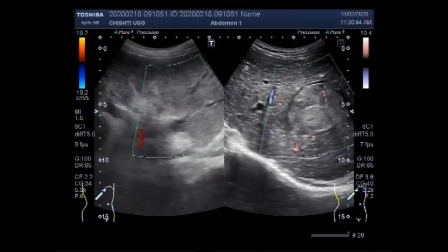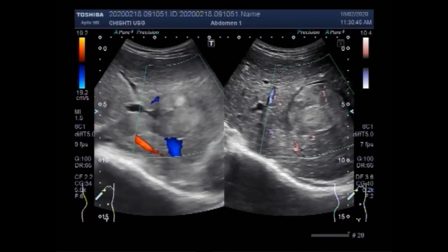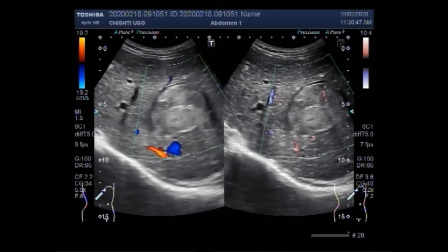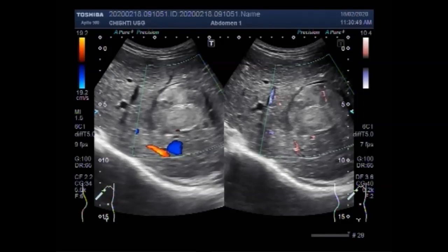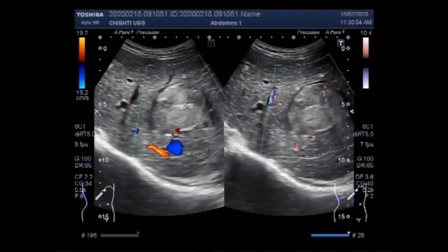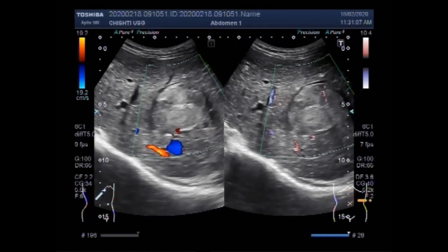You can see significant blood flow within the hepatic mass. The mass is round to oval in shape. It is semi-solid to solid in consistency with no fluid in its interior.